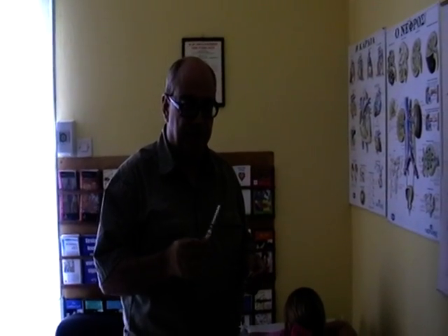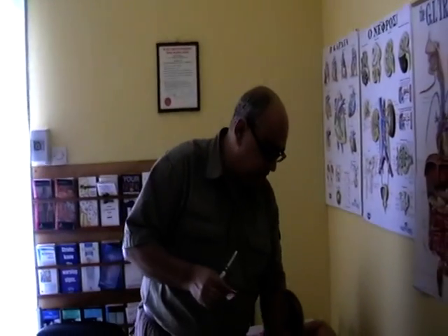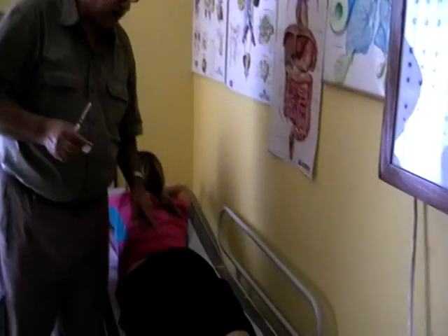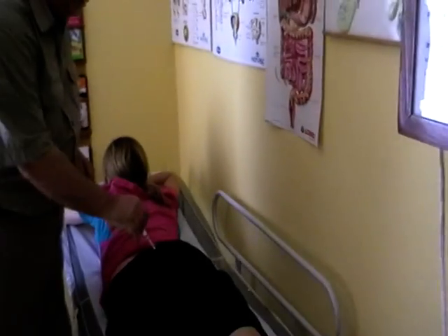We're going to show how to do a contraceptive injection called Depo-Provera intramuscularly. I've just removed any air that was in the syringe. The area where we do the injection is the left gluteus muscle — could be the right one as well. Imagine this is a round area, a circle; you divide it with an imaginary cross into four segments and go to the outer-upper segment, in this area here.